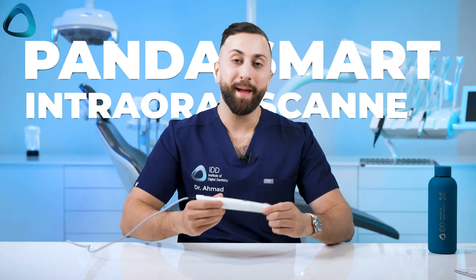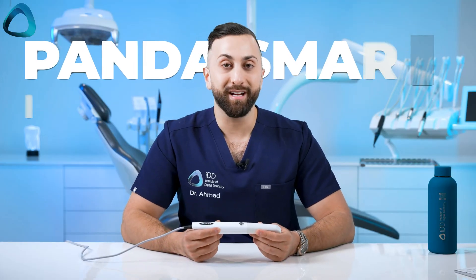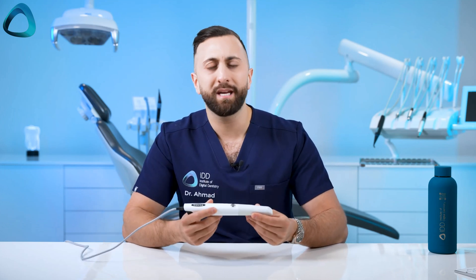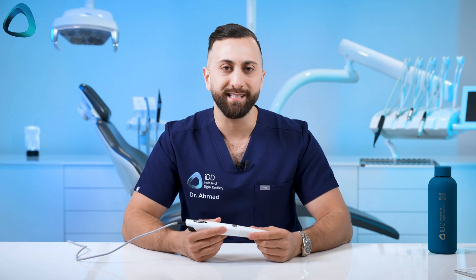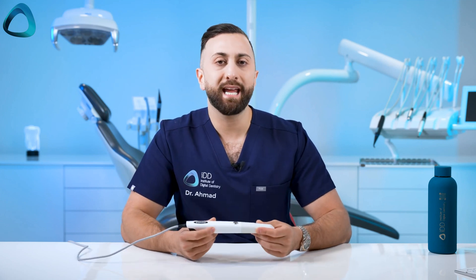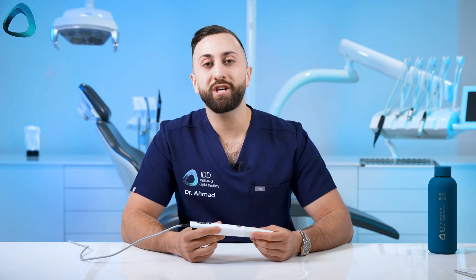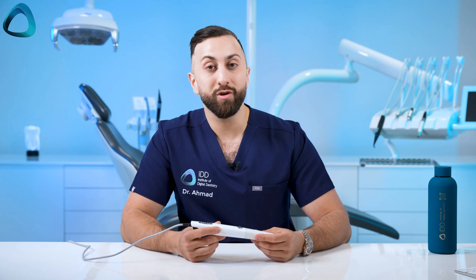This is the Panda Smart intraoral scanner which I've been using in my clinic for close to six months now for basically all indications — simple crown and bridge scanning, edentulous scanning for implants, etc. Over that period I've had a lot of time to reflect on how the scanner competes in this market. I've already released an unboxing video with all the key details, so check that out first. For this video I wanted to share the pros and cons I've noticed during clinical use.